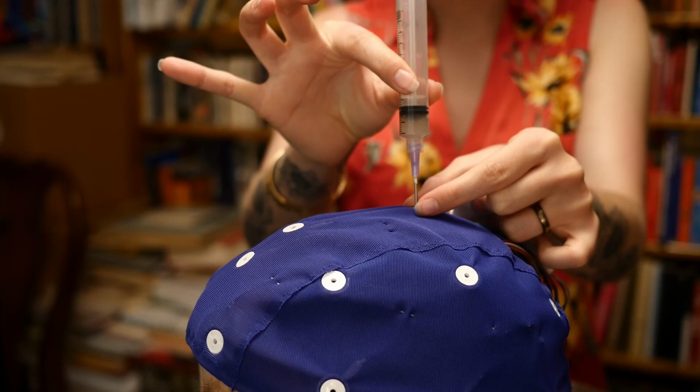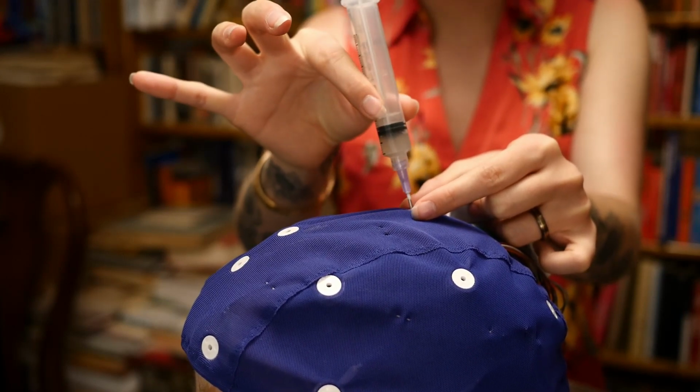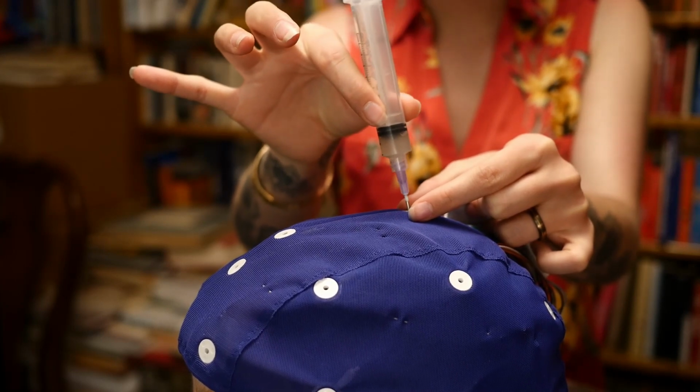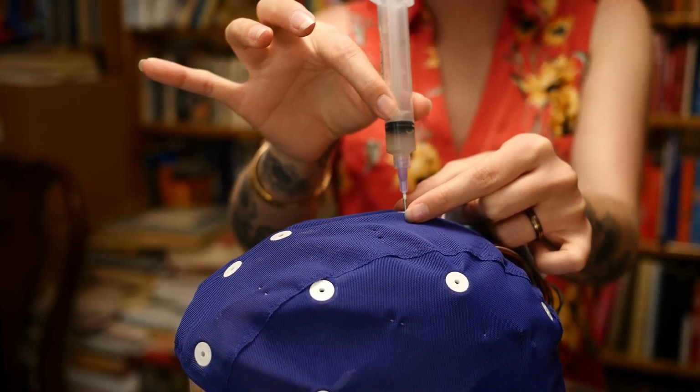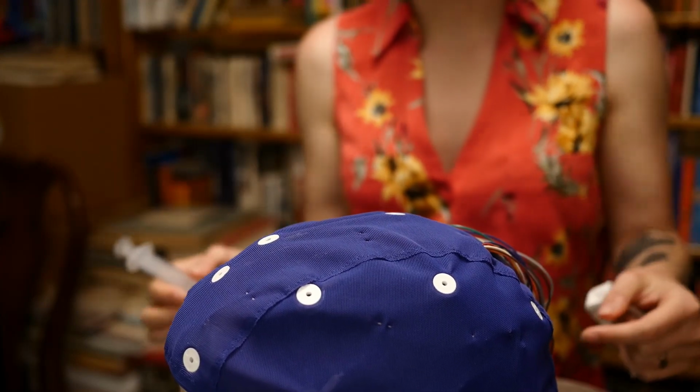Here you can see it from another angle. We are pressing ever so gently, no real effort there, just allowing it to distribute the gel more consistently through the electrode. You can do it at different angles, just make sure you're holding onto your electrode the whole time.